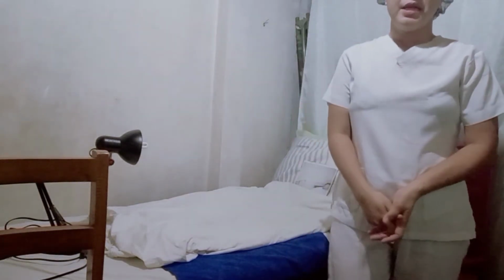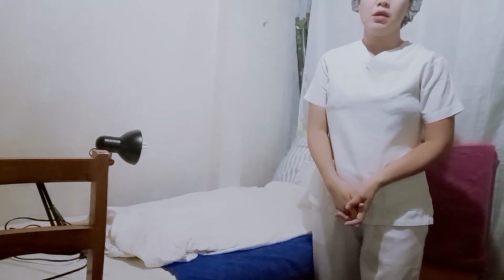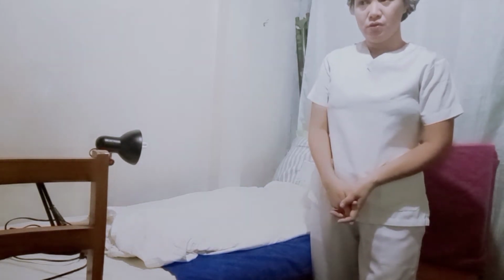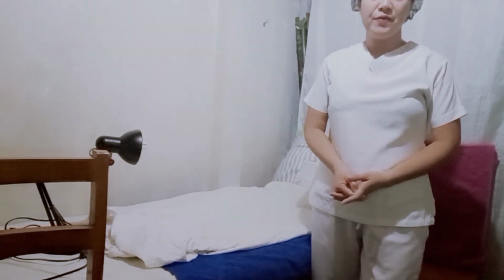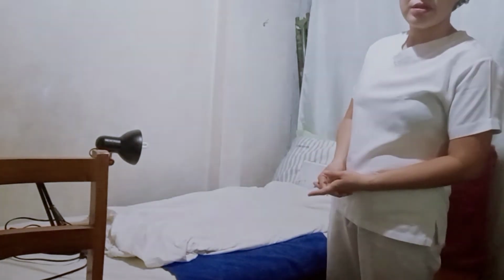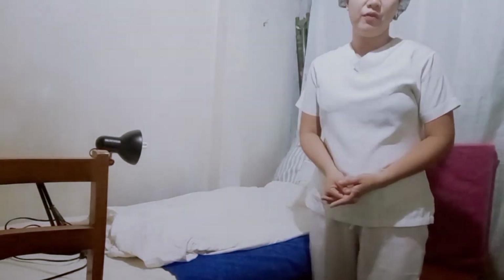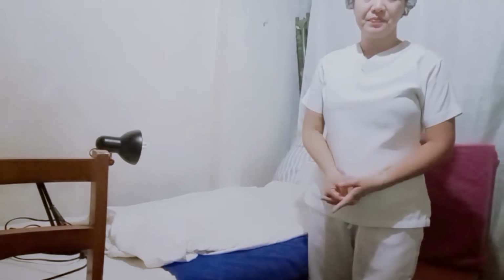And number 4, provide privacy. Every time we perform perineal care or a catheterization, we should close the doors or windows. This decreases the client's embarrassment and protects the patient's privacy.